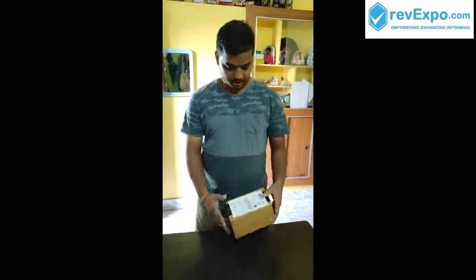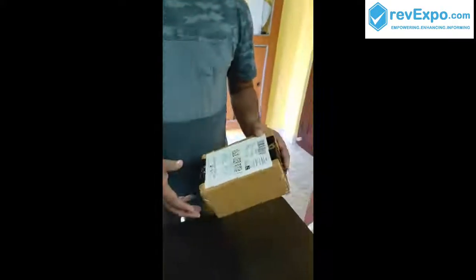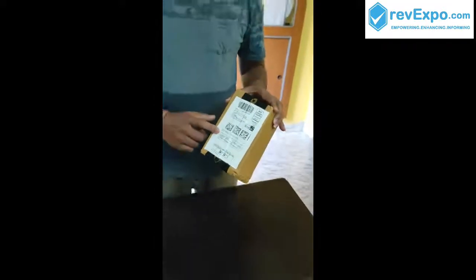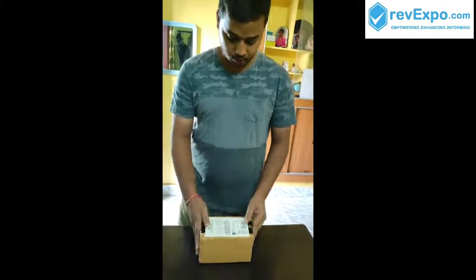Hi, this is Teja. I brought this from Amazon. Today I am going to unbox this. This is the product I brought from Amazon. It is a glucose test machine that we can use to check sugar at our home.